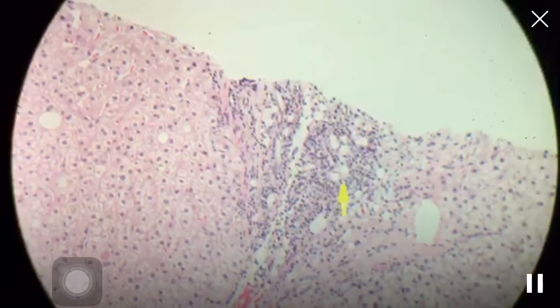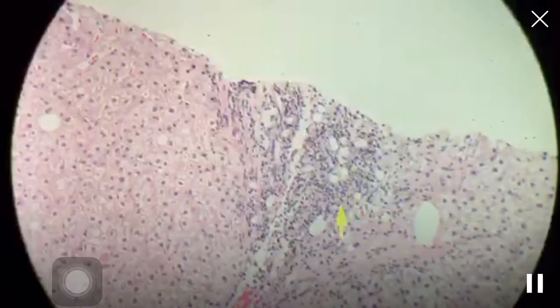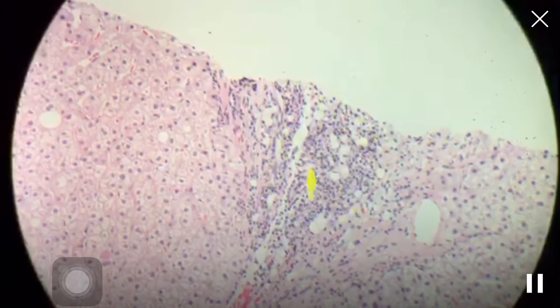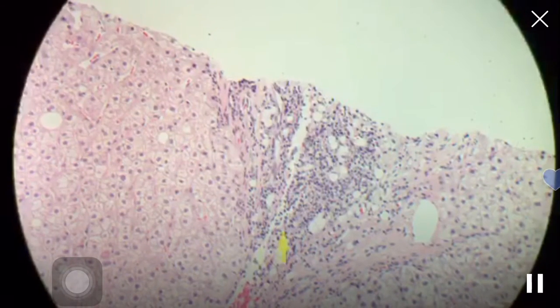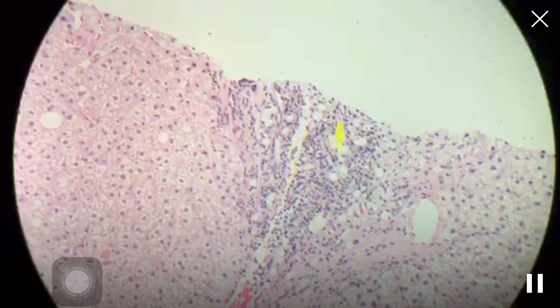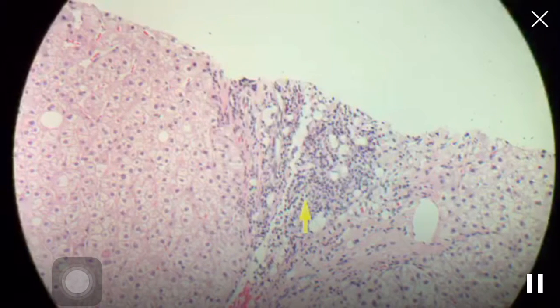This has some mononuclear cells. It also has fat. This fat is probably in macrophages. This is probably like an inflamed lipogranuloma. So there was probably more fat in this liver before. It was released and got taken up by macrophages that are carrying it out through the portal tract here. But there's inflammation.